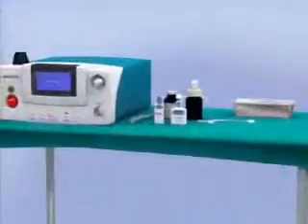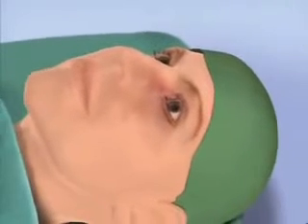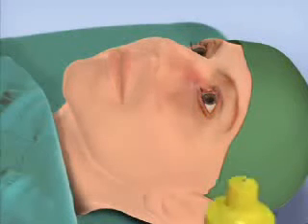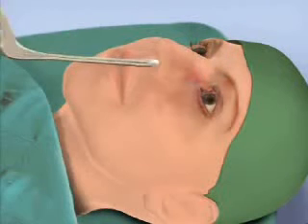Advanced techniques in laser-assisted dacryocysto-rhinostomy. We are now seeing considerable advances in surgery using minimally invasive techniques that reduce surgical trauma and allow fast, smooth patient recovery. Because of the reduction in operating time afforded by the laser, dacryocysto-rhinostomy can be performed with topical anesthetics applied to the eye surface, excretory lacrimal duct, and nasal cavity. Local regional injections are not needed, and this contributes greatly to alleviating the patient's anxiety and reducing intraoperative risk and postoperative sequelae.